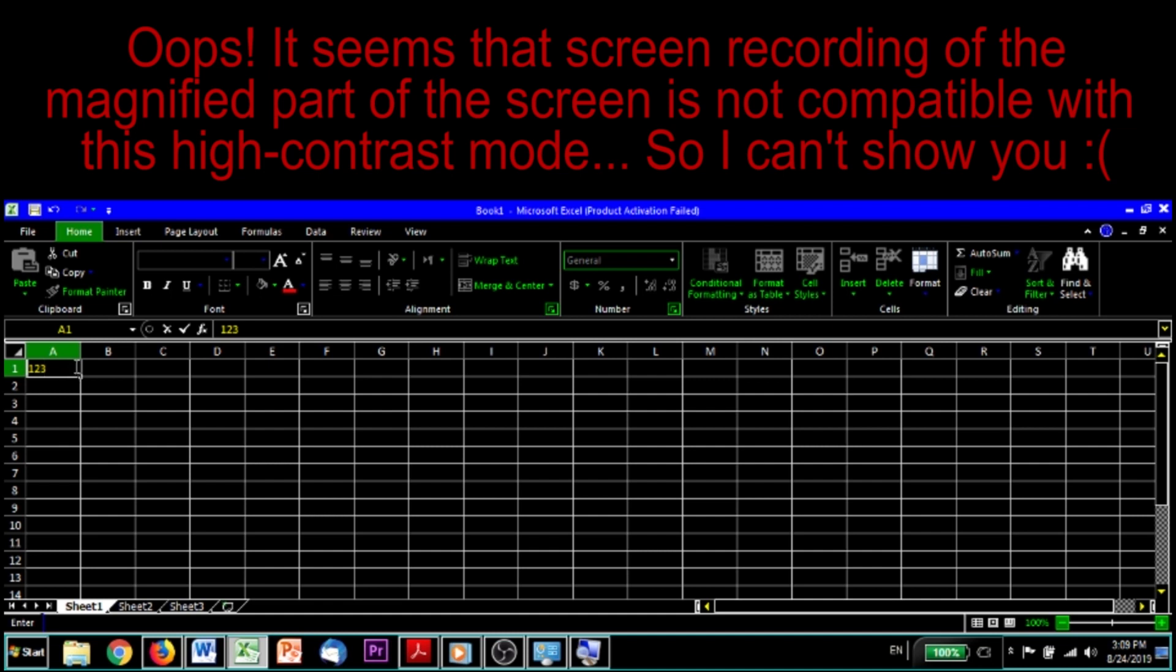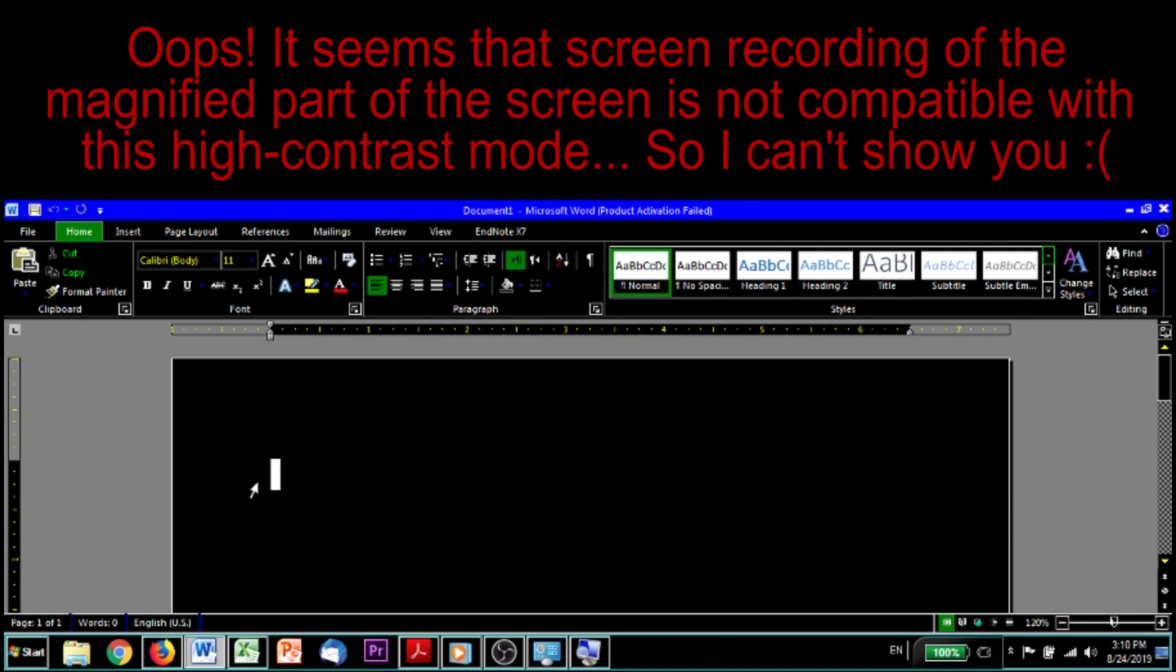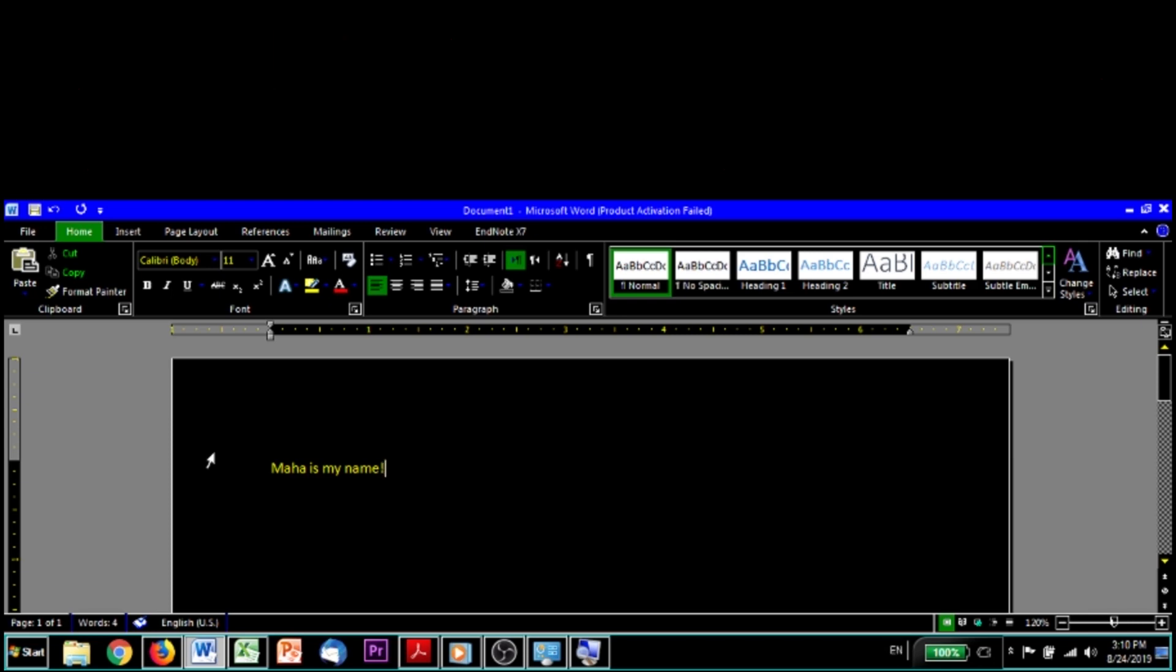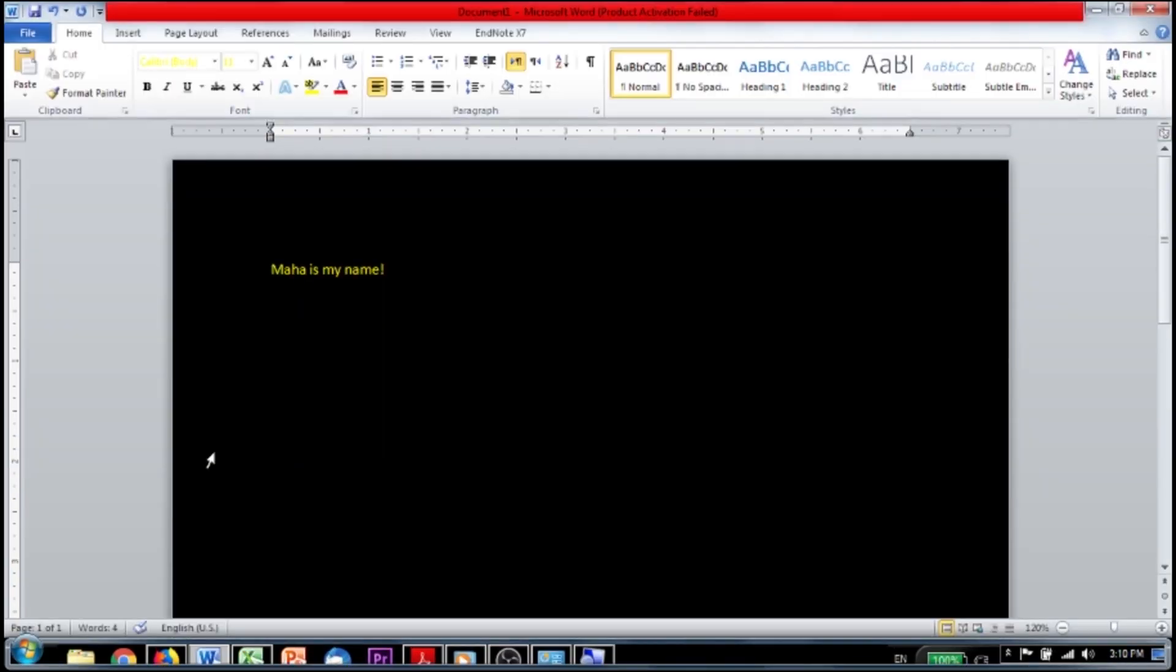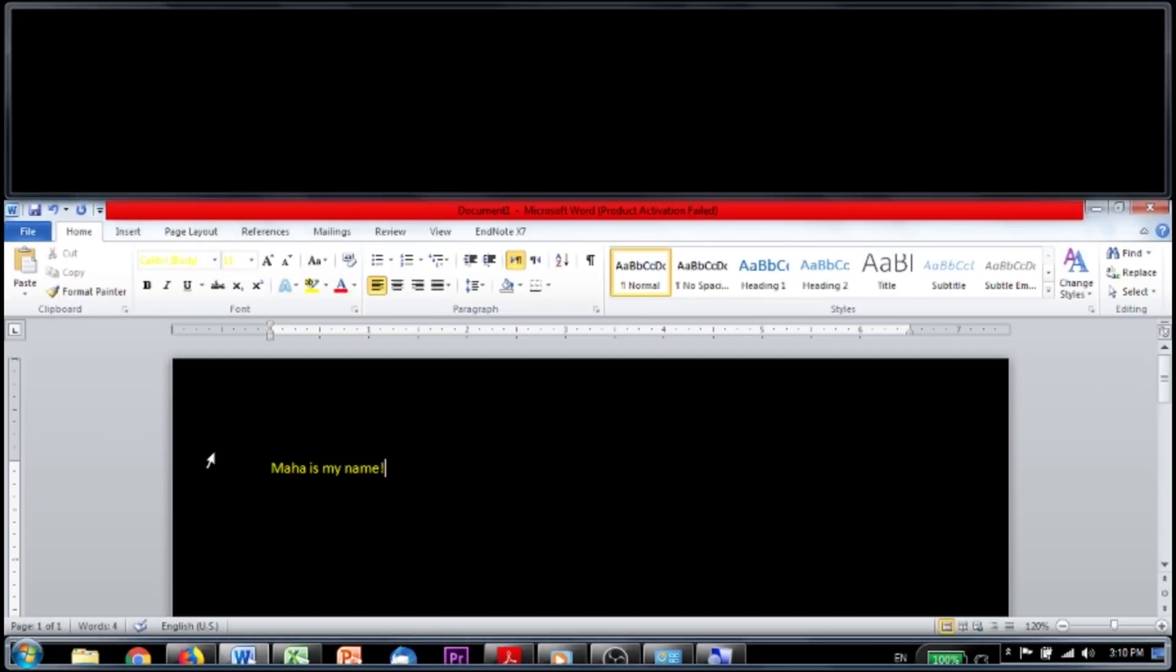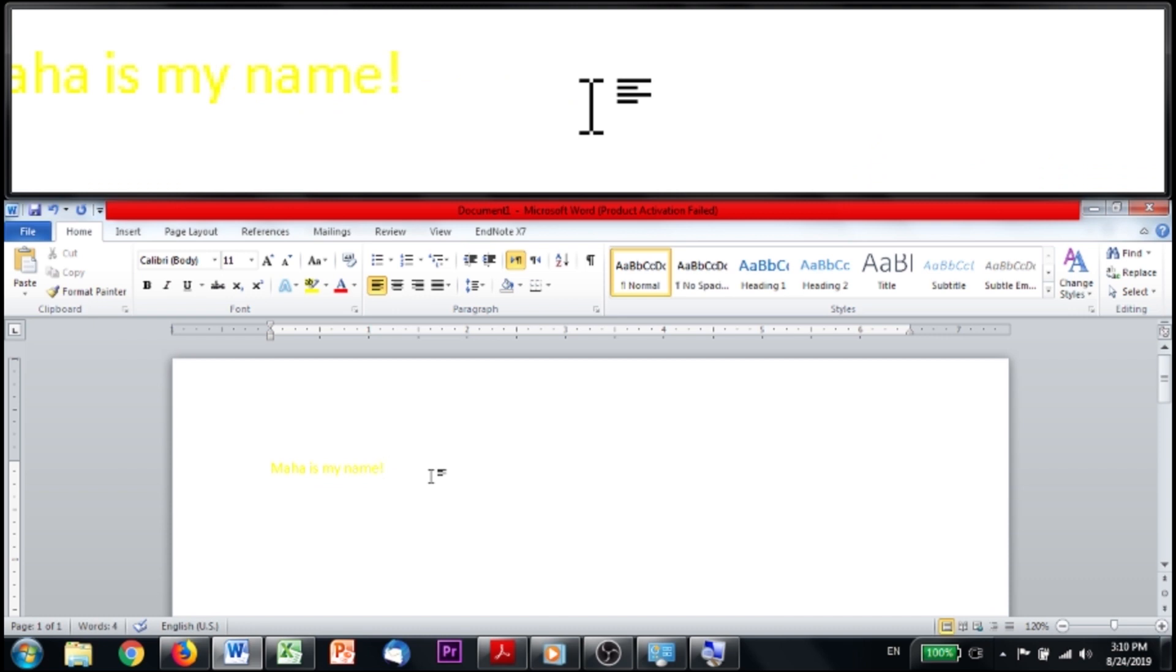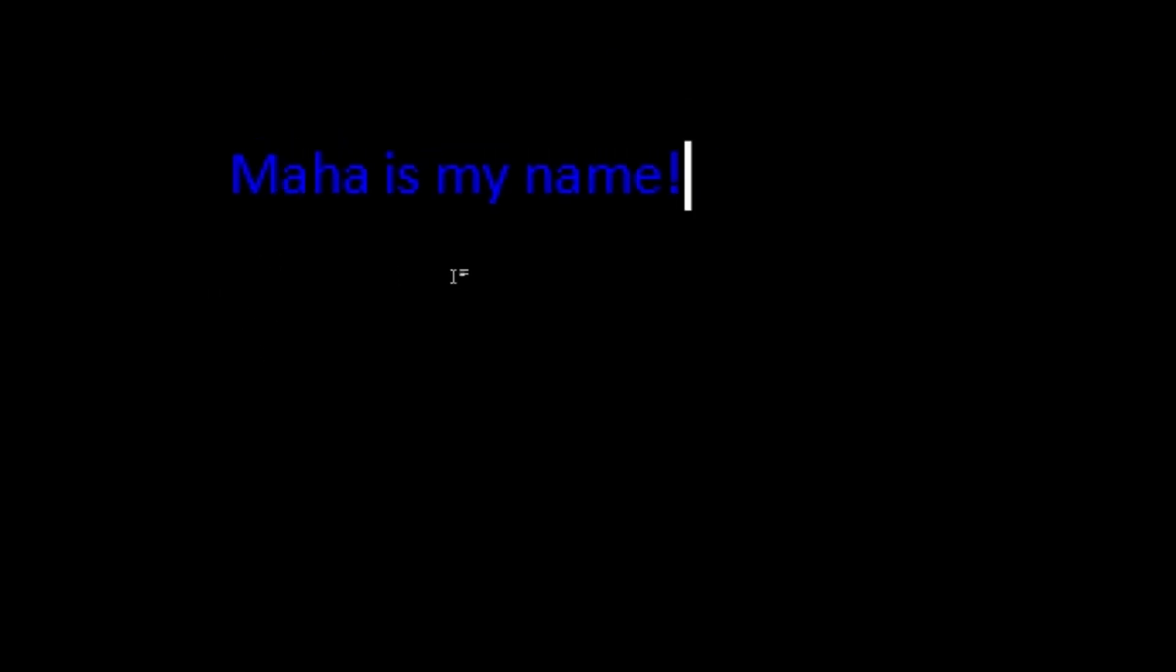A lot of people find this very comfortable. A lot of visually impaired people prefer this. I recently prefer this as well. Same thing goes for this Word document here. It'll follow my text and it'll be light text on a dark background. But I don't like this mode because as you can see here in the magnified portion of the screen, it blurs everything a little bit. The resolution kind of goes out the window once you're in that mode. So I prefer not to use that mode. And instead, if I want that extra comfort for my eyes, I will go for the full screen mode and then invert the colors. And here you go. And I can keep typing like this.